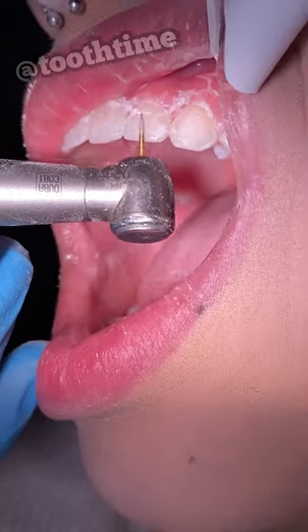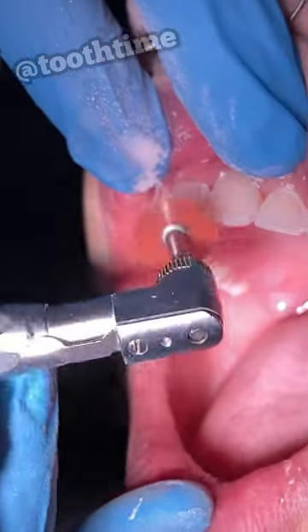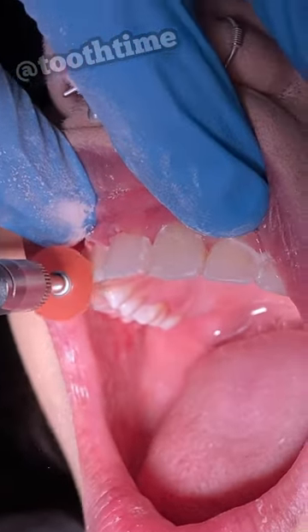We're going to go ahead and use our hand keys to remove any of the glue and make all the surfaces smooth. This right here is just shaving a little bit of her teeth on the front to kind of make them a little bit more defined and symmetrical.